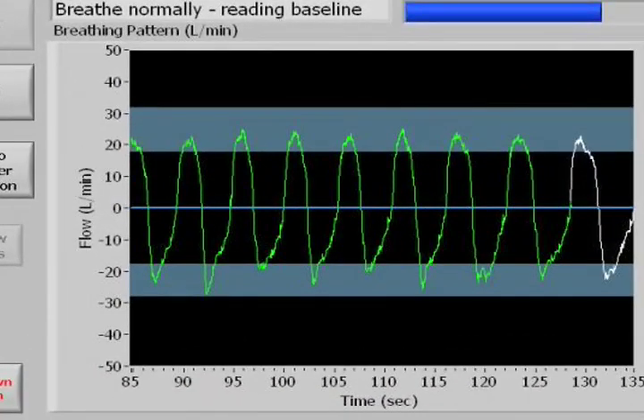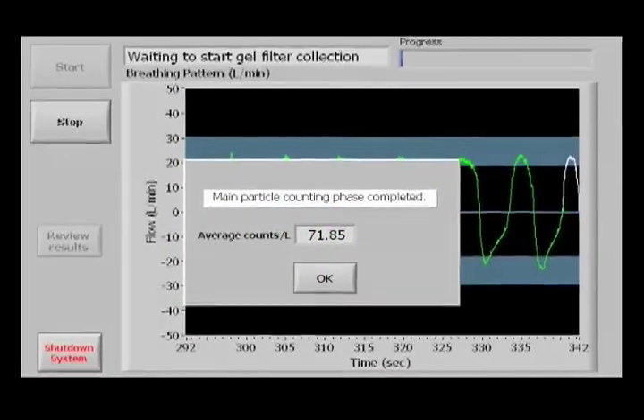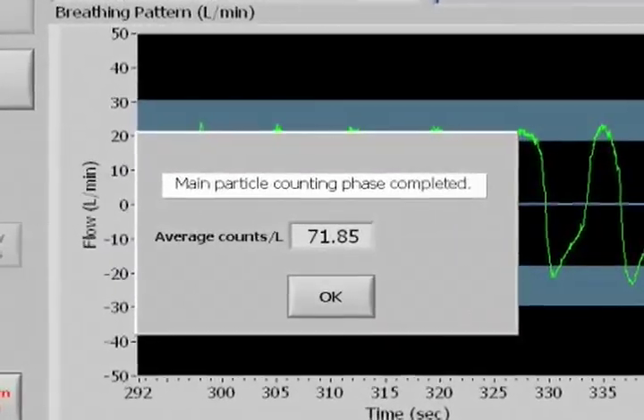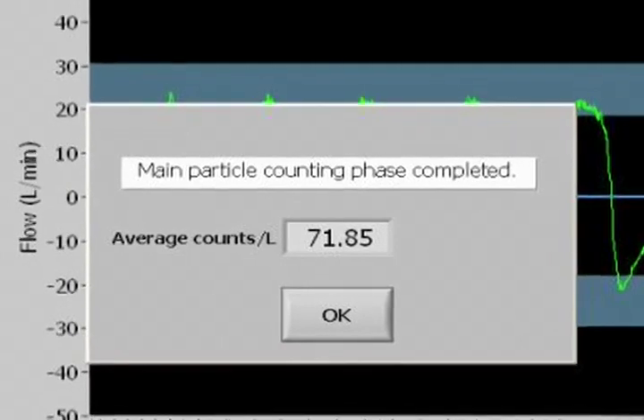After completing the practice section, the measurement section starts and they need to complete fifteen additional green breaths. That ends the particle measurement test, and the average number of particles in each liter of air they exhale is displayed on the screen. Typically, the time to complete this test is between two and three minutes.